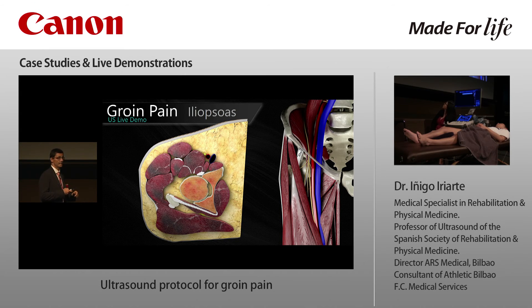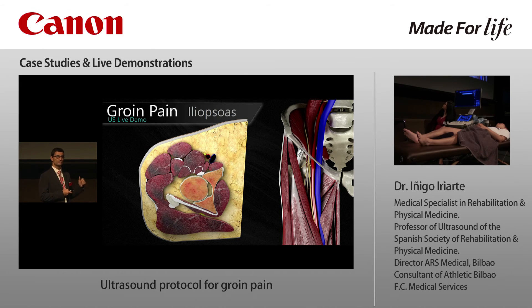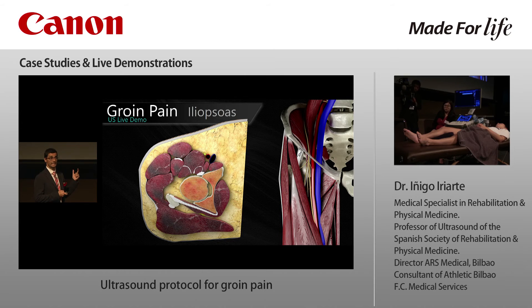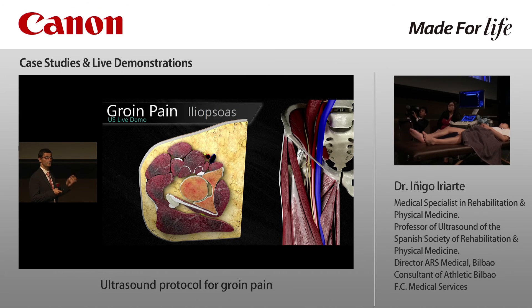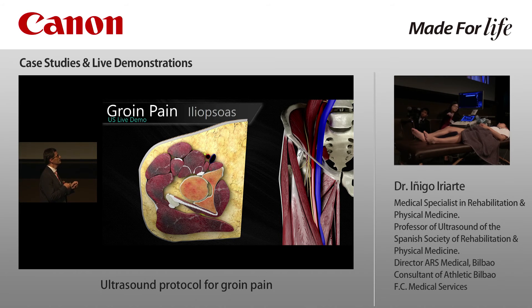The iliac muscle has usually two components, the medial component and the lateral one, separated by this fascia here, and a small thickening of the fascia here, which is the iliac tendon. So we will have a big tendon of the psoas major with a small muscle, and a big muscle, the iliac muscle, with a small tendon. There is another muscle called the ilio-infratrochanteric muscle, which is more lateral to the iliac muscle.